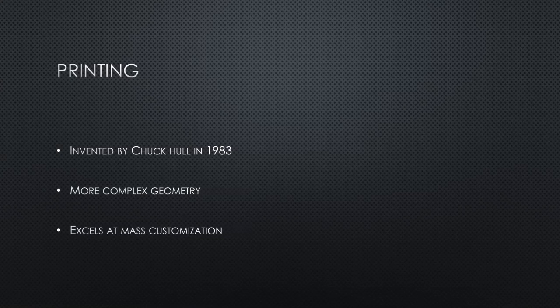With printing, many of the limitations of subtractive manufacturing are solved. You no longer have to consider your tool geometry, and undercuts are no longer a problem. That's not to say that printing is superior to milling. It has its own drawbacks as well. You do need to support your prints appropriately for them to print successfully, and your print sizes are instead limited by the actual physical limitations of your specific printer.